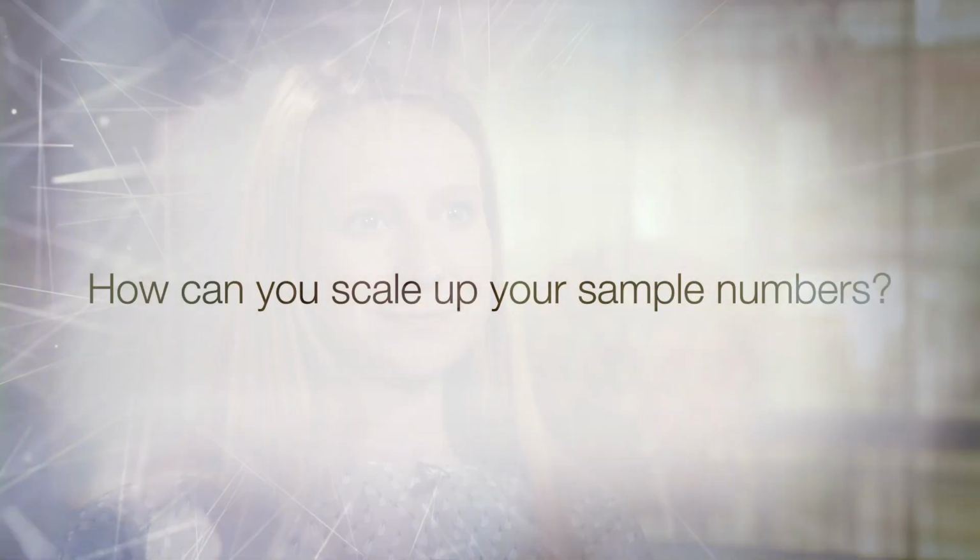So we could run 2 96-well plates simultaneously, and over the course of a 7-day working week, this means that you could run 1,000 samples per week. And screening labs in the UK really vary in terms of the numbers of samples that they receive. But for example, Sheffield Newborn Screening Lab receive about 1,000 samples a week. So proving that we had a protocol that could analyse 1,000 samples a week was really helpful.